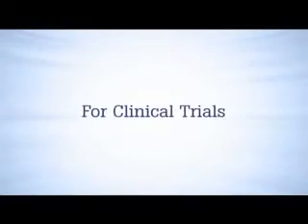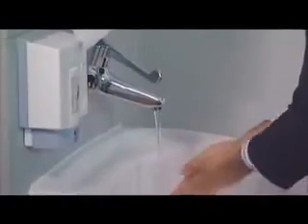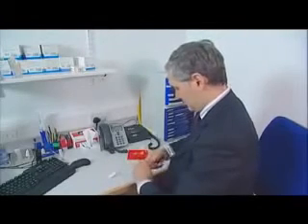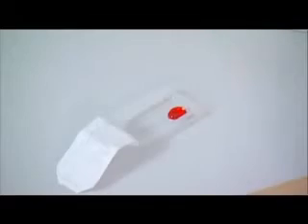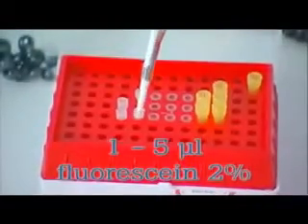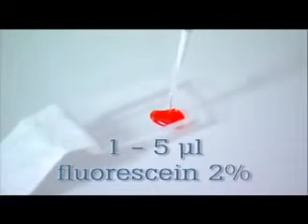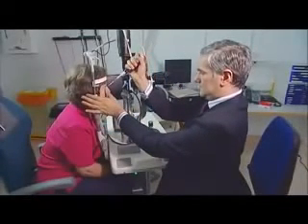For clinical trials, the tests are performed slightly differently to improve standardization. The procedure is as follows. A drop of sterile 2% fluorescein is placed in the sterile casing from a unit dose dispenser. A sterile tip is fitted to the variable volume pipette. The volume is set, and that volume of fluorescein is aspirated into the pipette. This precise volume can then be instilled into the lower conjunctival sac.